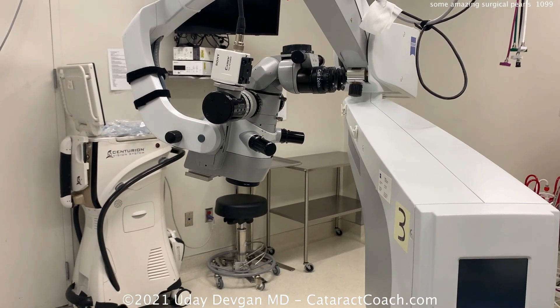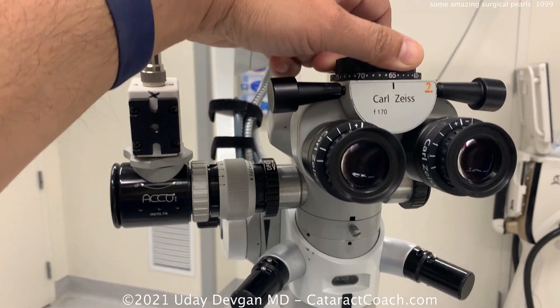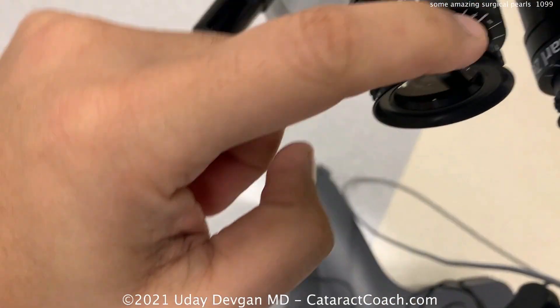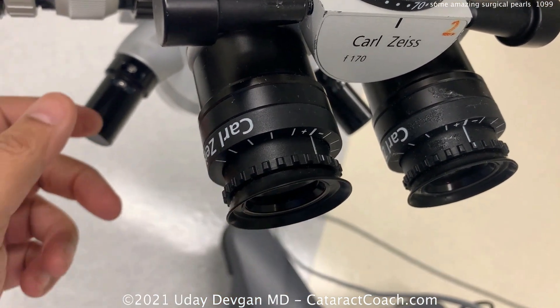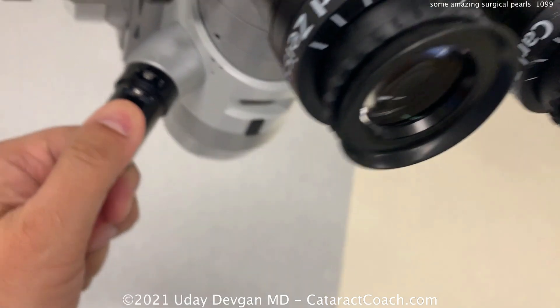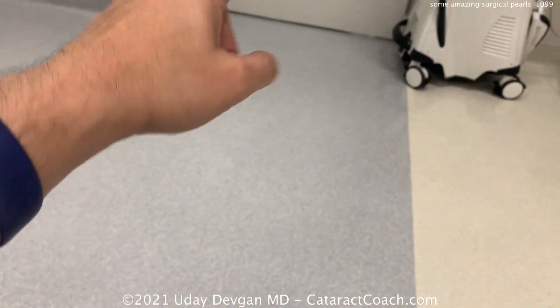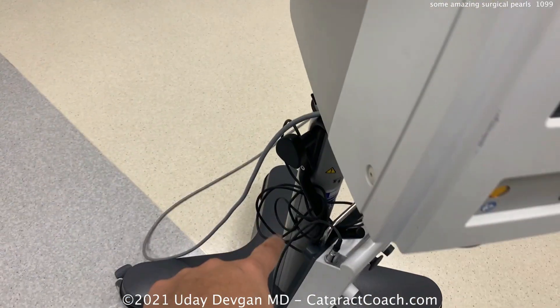Let me show you the microscope. I check my PD and set it to where I want it. You can check the oculars, make sure they're both zeroed out — or dial in whatever refractive outcome you desire. The camera is here and ready. Check the oculars are clean, and set up the pedals.